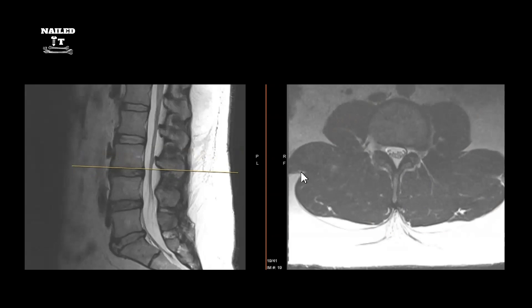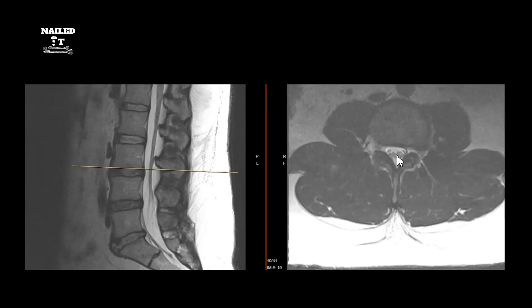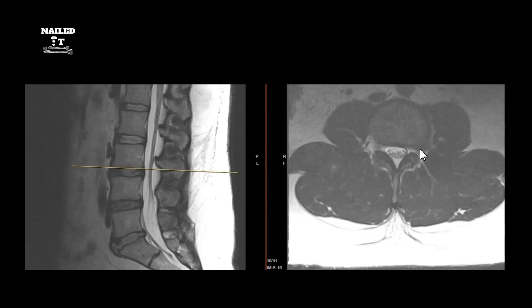Centrally there may be a small bulge but nothing causing significant stenosis or pressure on the nerve roots. Going through the axial, the right-side exiting nerve root looks free. On the left side, the exiting nerve root gets tight — it looks like there's a disc bulge right there putting pressure on the exiting nerve root. This is how it should look when free, exiting through the foramen to innervate its dermatome.